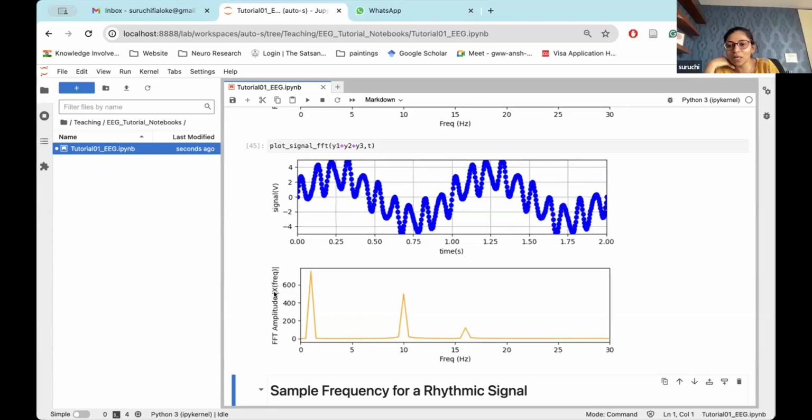But they do that somewhat in the sleep stage. They are doing mostly the same thing, but not completely. So you'll see more of a combination of delta and stuff. We can get into that as interpretations of these waves, what they mean, if you're interested. But mostly this much analysis part you have to understand, so that when you're presenting a result, you understand what it is that you're presenting. That much is important.